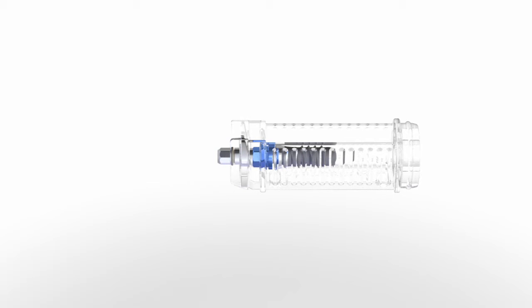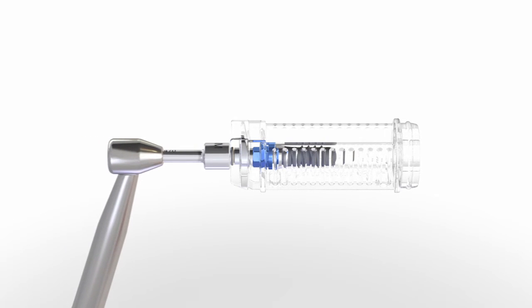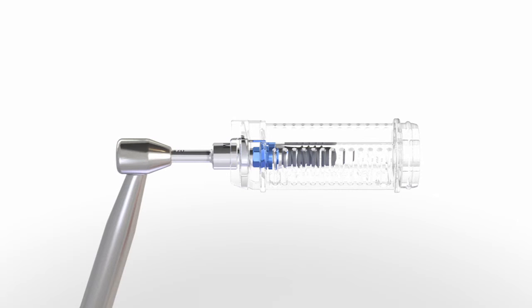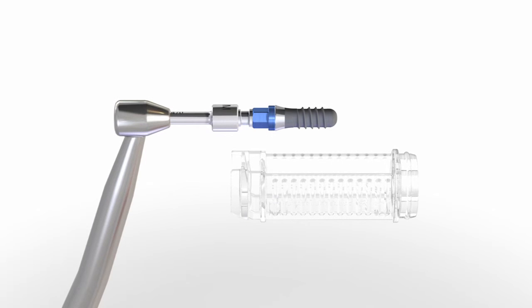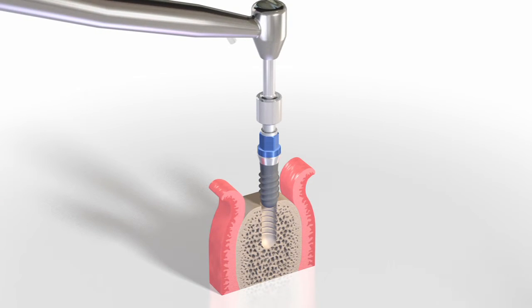Another option is to use the handpiece to insert the implant. The implant carrier should be held at its closed end, and the handpiece adapter pushed onto the implant until there's a click. Simultaneously, the implant carrier is pulled down and the implant is lifted out of the implant carrier. The implant is placed with the handpiece into the implant bed.